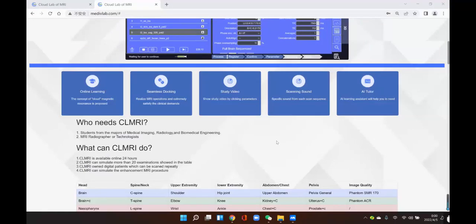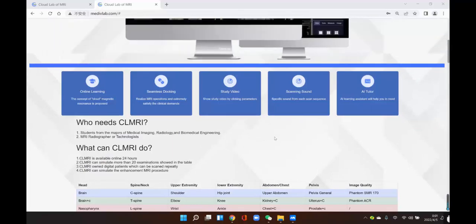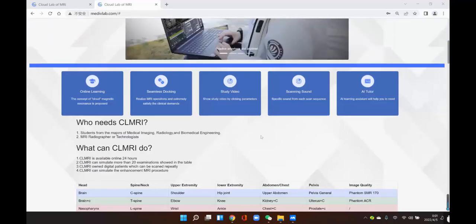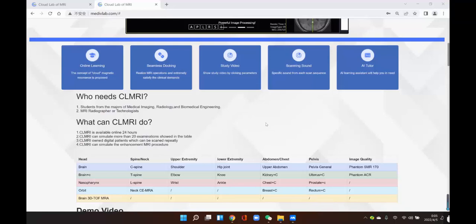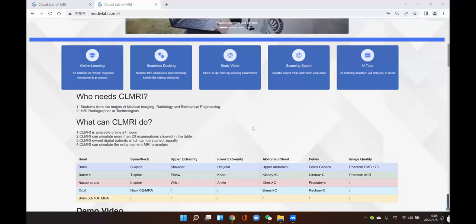In the homepage, we introduce the features of this software. CLMRI is designed for students in the major of medical imaging and for radiographers. There are more than 25 examinations that can be operated in CLMRI, including head, spine, abdomen, and contrast enhancement.